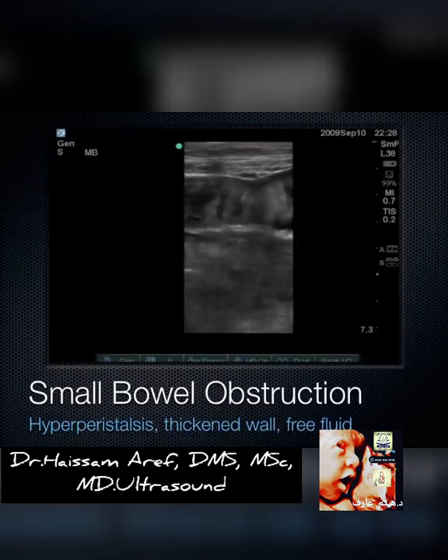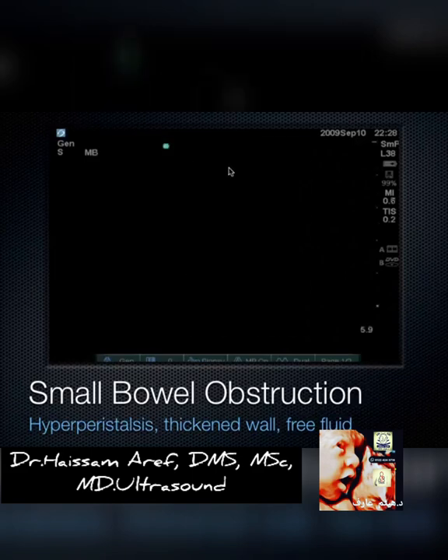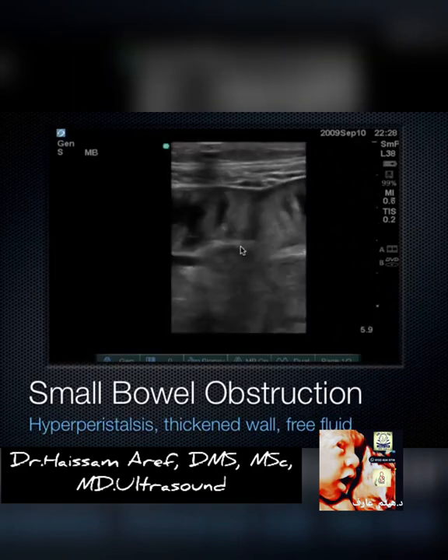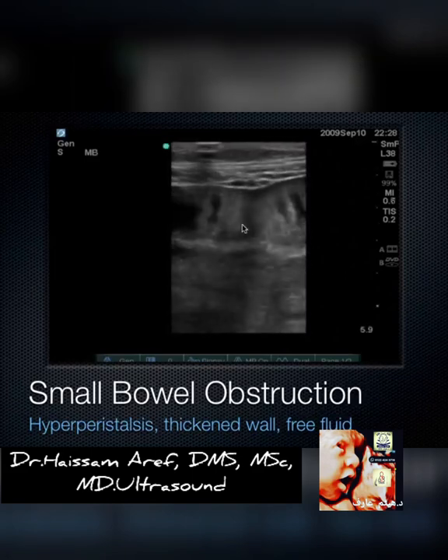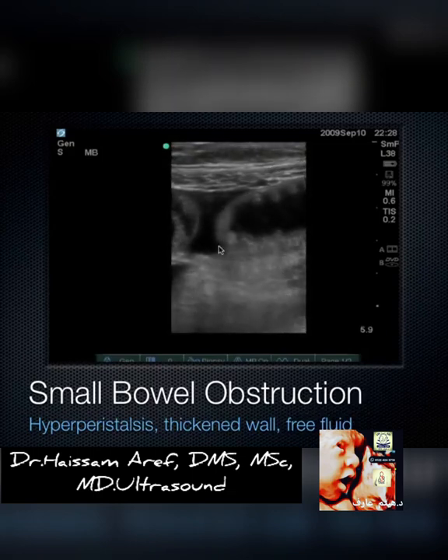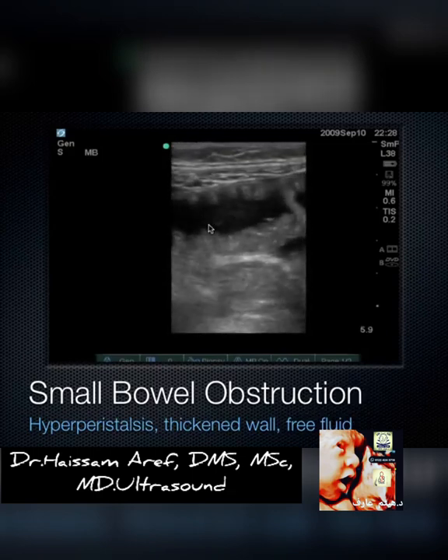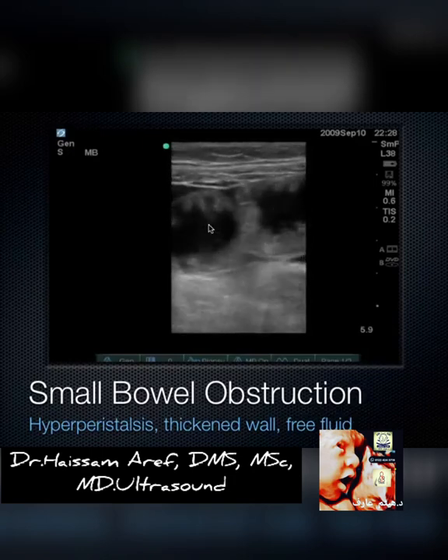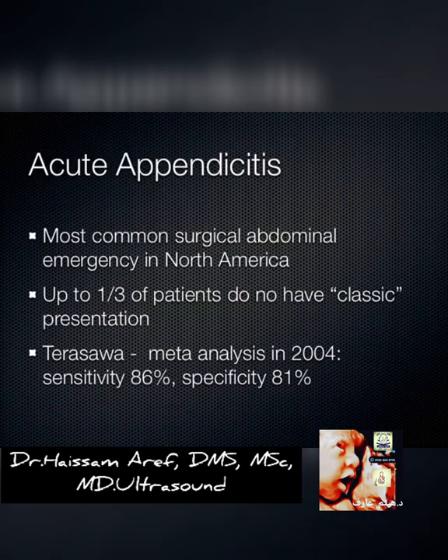Here's another example of small bowel obstruction. We can see the plicae circulares going across a pretty dilated loop of small bowel, and fluid surrounding and between two loops next to one another, which tells us there's probably been perforation.